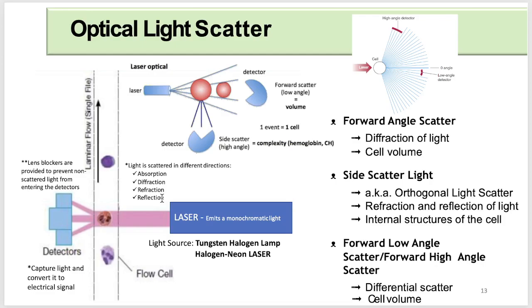And then, what will happen? The detection of your scattered rays and their conversion into electrical signals is accomplished by your photodetectors. Again, ito na yung photodetectors that will detect your scattered light and convert it into electrical signal. Ito yung tinatawag natin na photodiodes and your photomultiplier tubes at a specific angle. So, meron tayo silang mga specific angles. Ano yung mga specific angles nila, Doc Von?